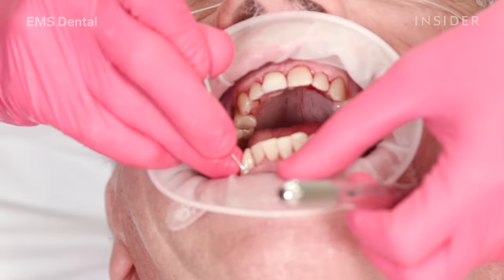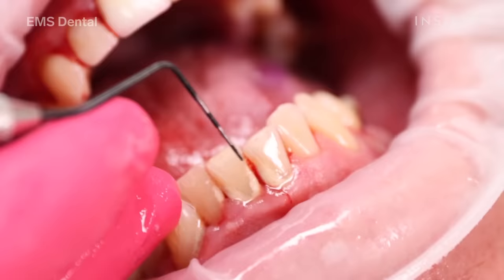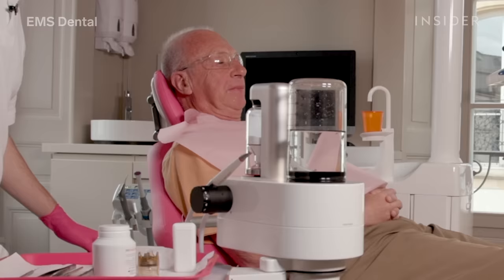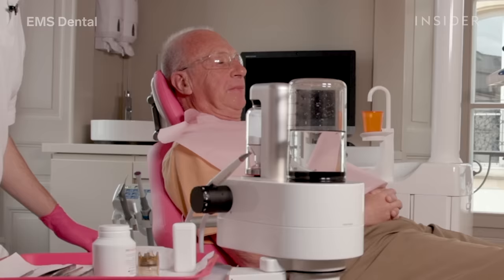Learning good oral hygiene habits is like learning to swim — you have to be shown, so ask your dental hygienist to teach you how to clean your teeth properly. Spend the most time and concentrate the most effort on the areas you can't see: that's where you'll find the most biofilm — in between the back teeth, underneath the gum line, and around the base of restorations.